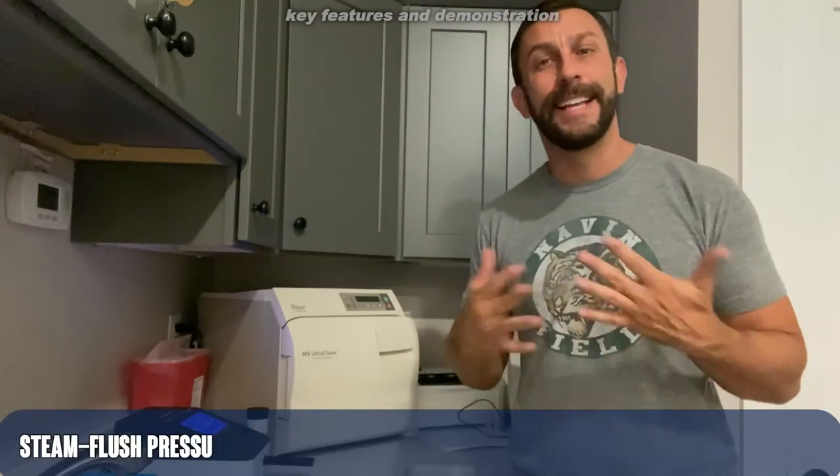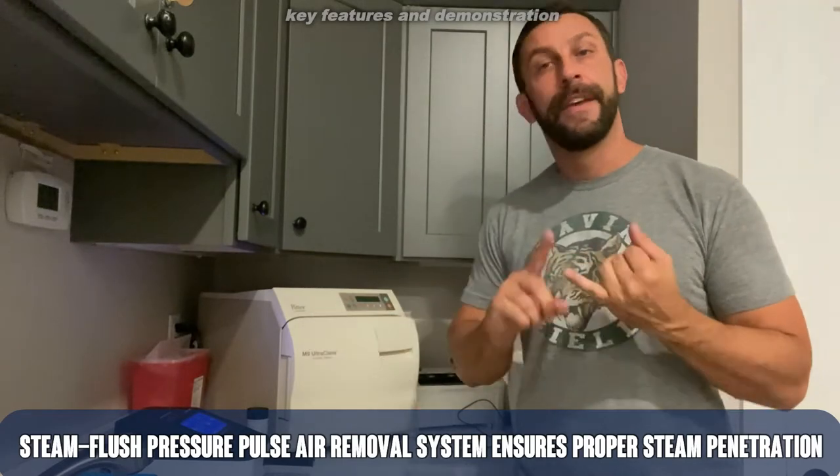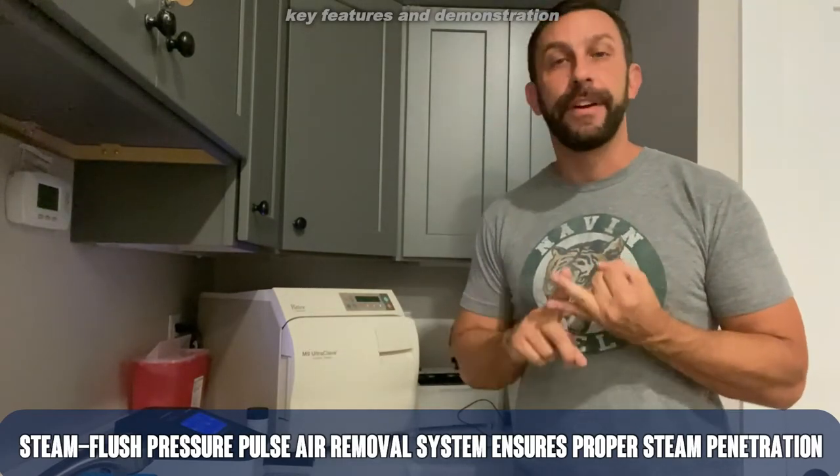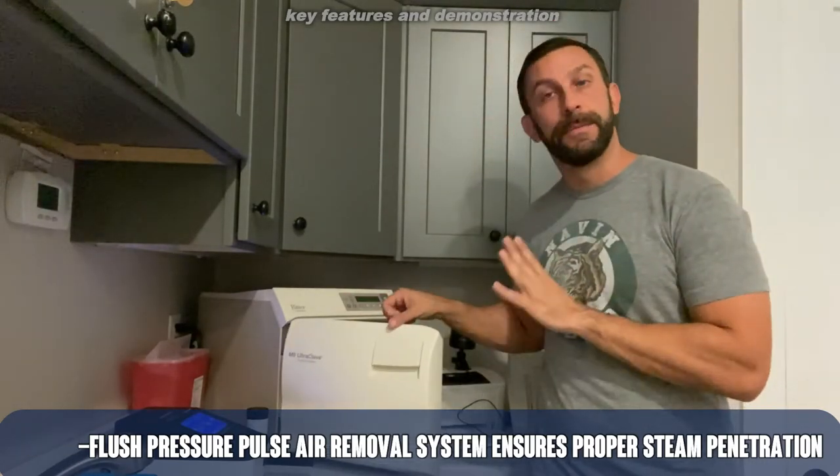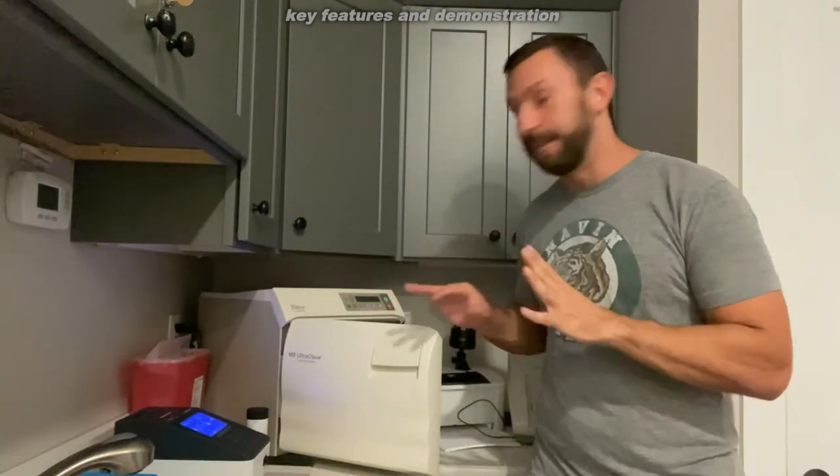If you have a doctor's office, dentist's office, something of the sort — this thing is very cost-effective, very efficient, and very easy to use, which is one of the key aspects here. You just put it in; it's almost like doing a load of dishes — set it and forget it.